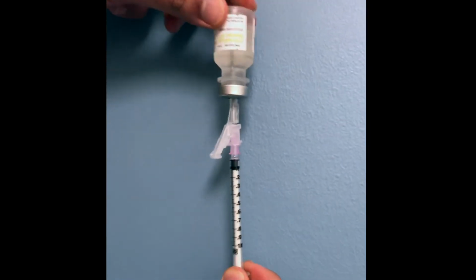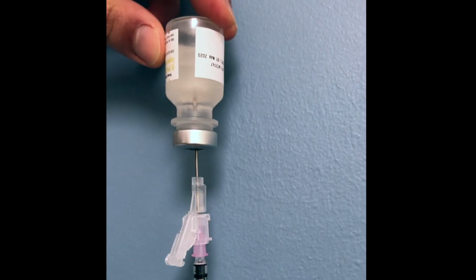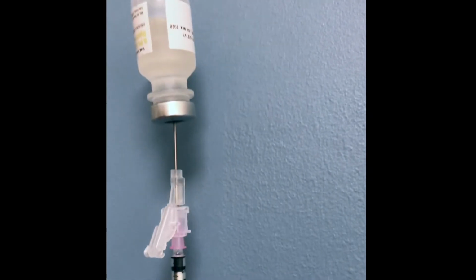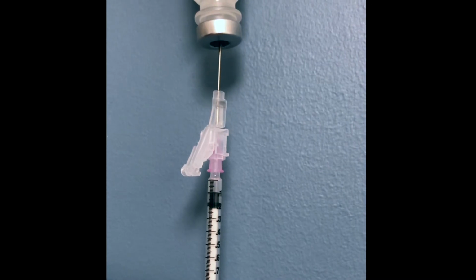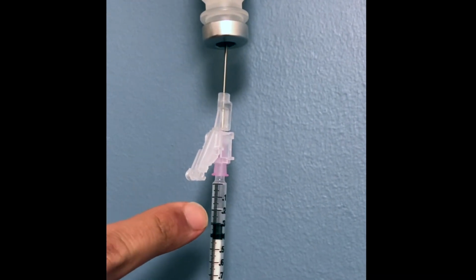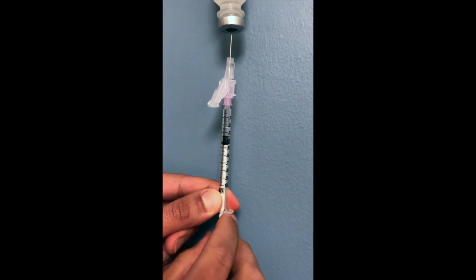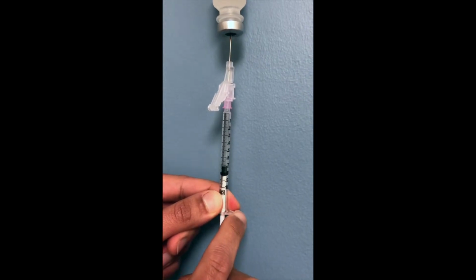So what I like to do, I'm not sure if you can see it, is pull the needle all the way down here. That way you're not going to be sucking in air. And what you do is you just pull down. And what you can see, I'm already sucking in a little bit of air right there, and that's okay. That's expected. What I like to do to make my life easier is pull the plunger all the way down so I get more than what I need.